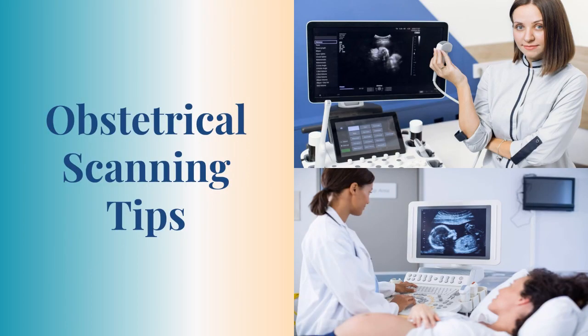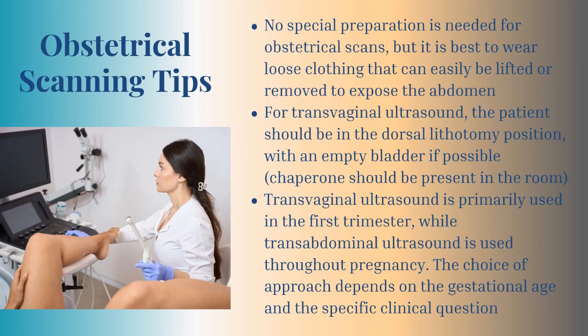Obstetrical scanning tips. No special preparation is needed for obstetrical scans, but it is best to wear loose clothing that can easily be lifted or removed to expose the abdomen. For transvaginal ultrasound, the patient should be in the dorsal lithotomy position with an empty bladder if possible. A chaperone should be present in the room.